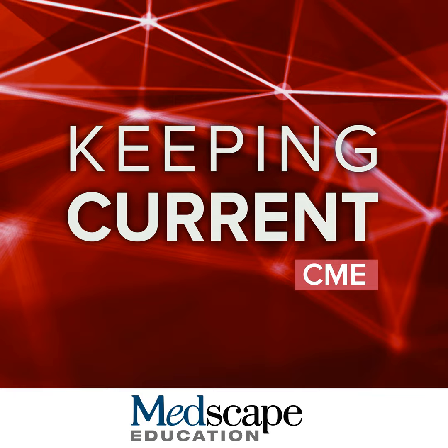A large study that looked at this approach showed that 97% had optimal AP timing, with only 2% of cases having significant or severe TSM artifact. This is just an example. Patient without dilution, you can see severe TSM on arterial phase. A follow-up study with dilution, perfect arterial phase timing and no motion.